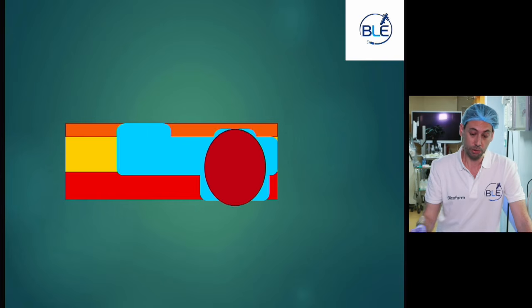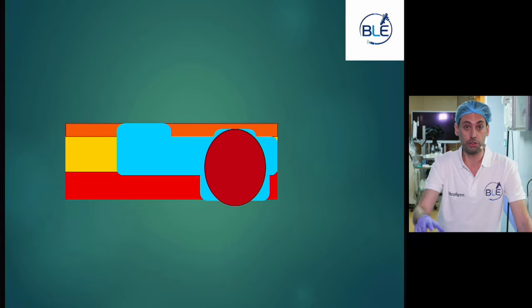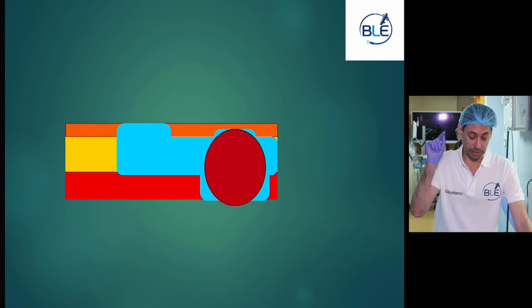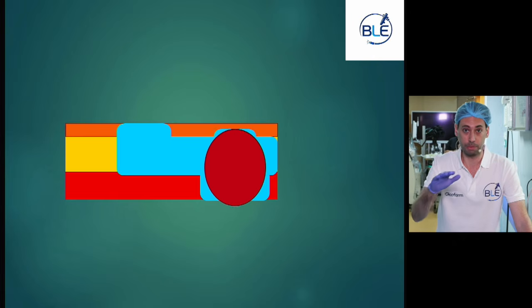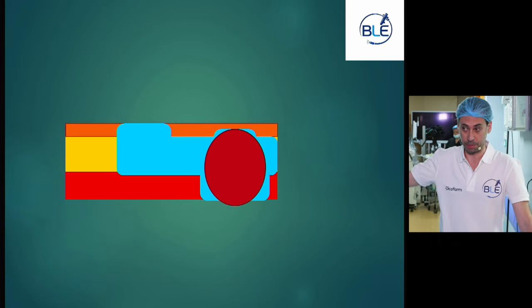Then we can do full thickness resection with perforation and closure, as the Chinese do, with endoloop and clips. We have also STER, and if the lesion does not penetrate the muscle layer, we can go with classic ESD up to the level of the muscle layer with intermuscular dissection, or even up to the serosa without perforation. But in this case, probably we'll do STER, and we will see the steps right now.